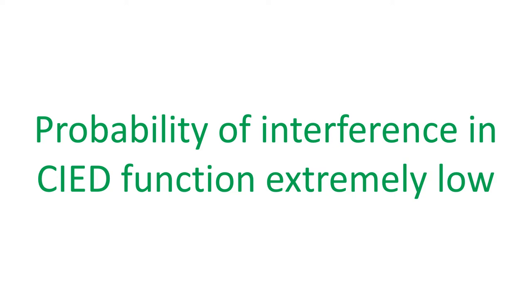Probability of X-ray electromagnetic interference is lower when the radiation dose and the radiation dose rate are reduced. Interference can be completely avoided when the implantable device is outside the primary X-ray beam of the CT scanner.